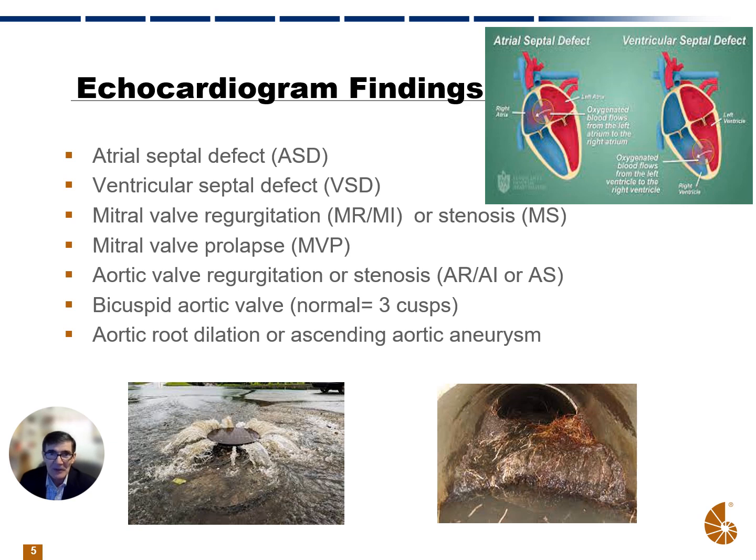So an atrial septal defect would need to be repaired usually, and the echo would be one way of determining if that is the problem.